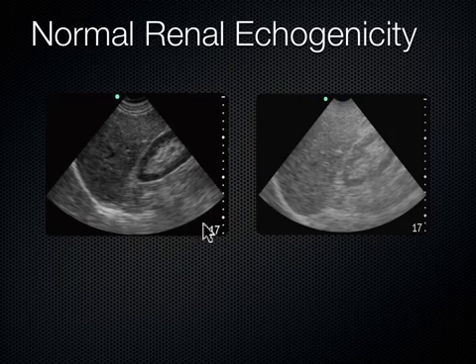Now, if you look at this image here, what did I do in terms of depth? What did I change here on the screen? What's the difference between these two images? They have the same depth. They both range down to 17 centimeters.